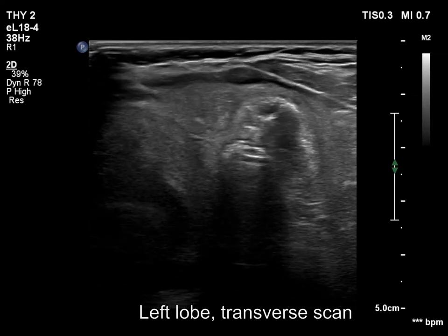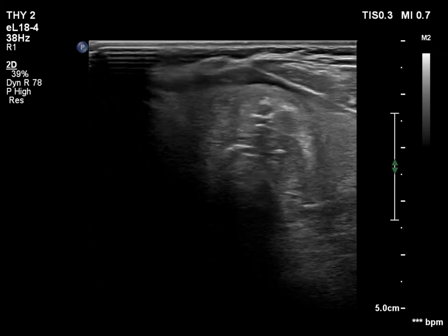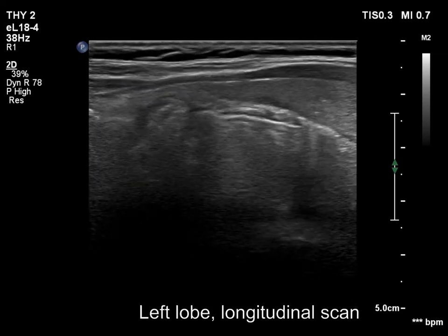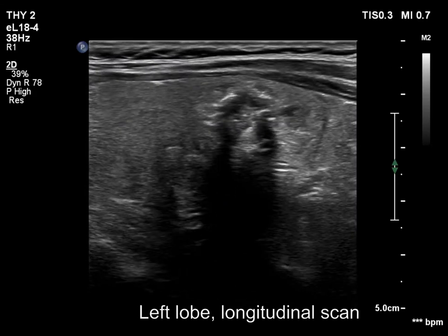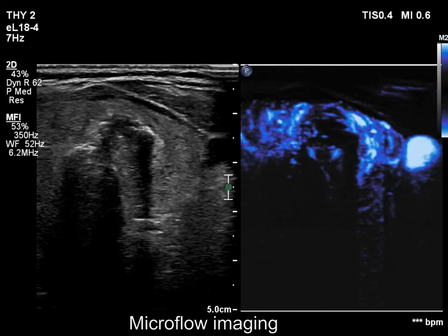The left lobe has a heterogeneous nodule with a similar pattern to the much larger lesion in the right lobe. The vascularity here is also scanty.